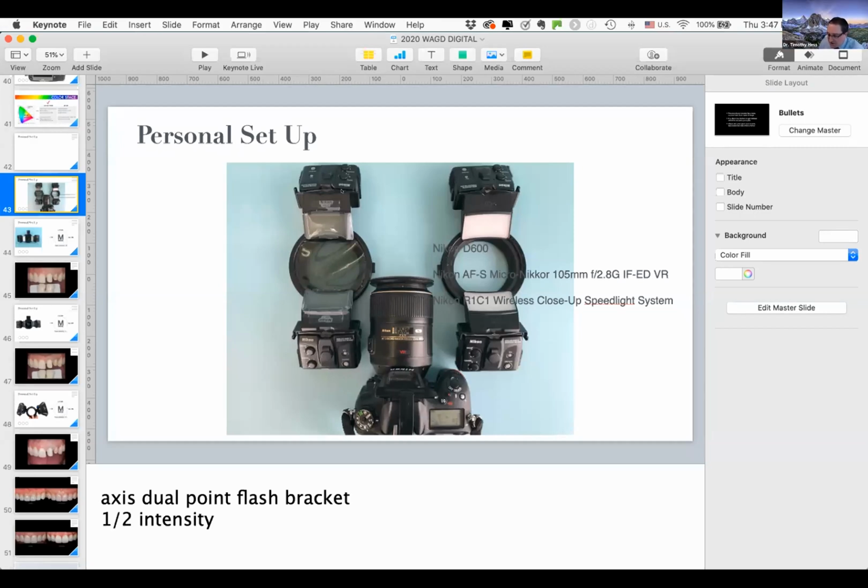Do you have any experience with the Shofu camera, which takes pretty decent pictures? Yes, Shofu has a point and shoot camera. Those are very nice cameras, and it's easy to use. So it's better than nothing for sure. The only thing is, I'm not sure if the Shofu cameras allow you to take photos in RAW form. So that's the only disadvantage. Like I said, I think RAW is king, and RAW is the most important shooting mode that you should be in.